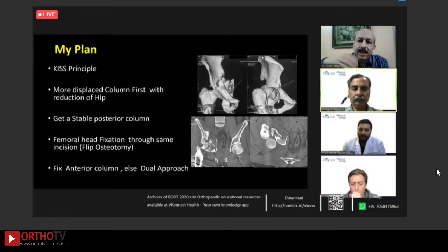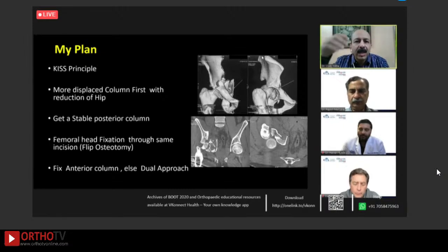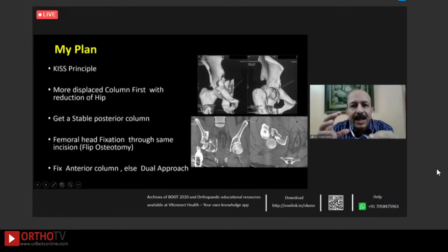Else, I will reverse the procedure and go in again with a lateral window with an ASIS osteotomy and fix my anterior fracture. What was worrying me was the comminution at that area. If you see where the fractures are, both at the anterior as well as the posterior column, there is a lot of comminution and flakes of bone. So I wanted to visualize it right in front of my eyes to get an accurate reduction. For me, there was no chance of inaccuracy, even a minor one, because we are dealing with three fractures.